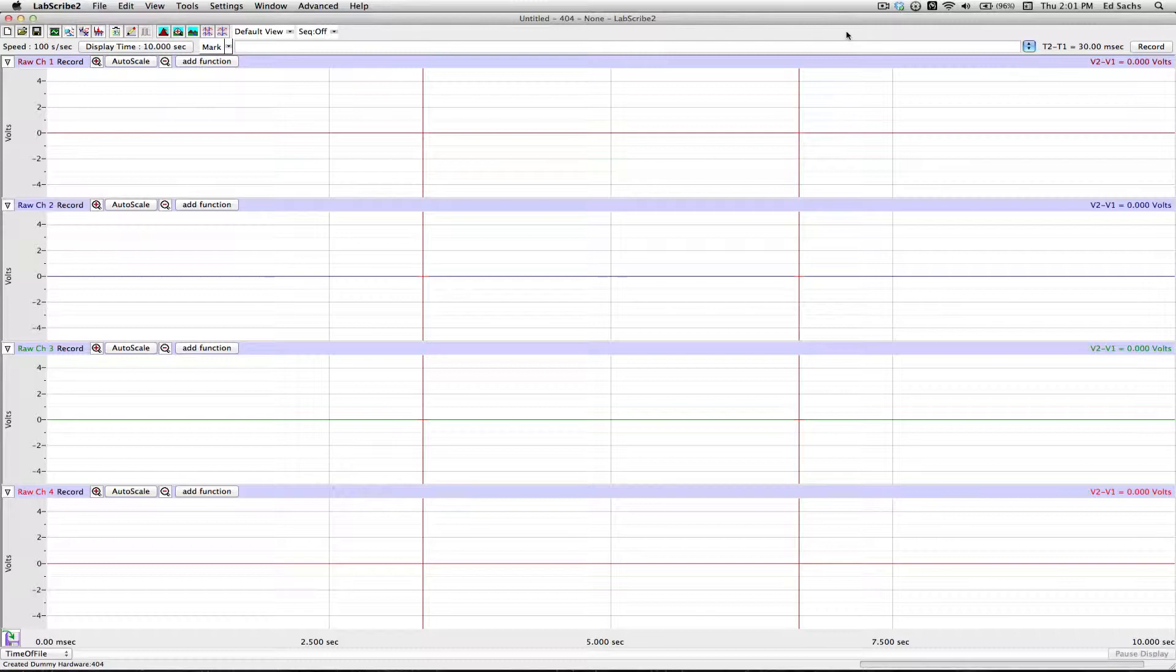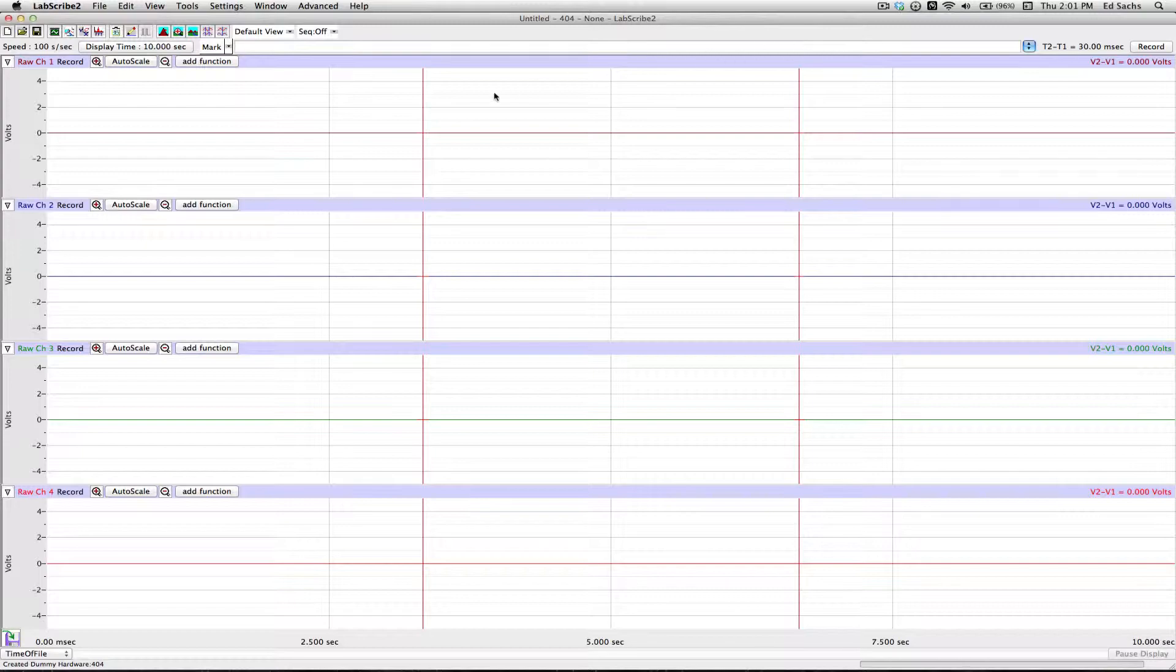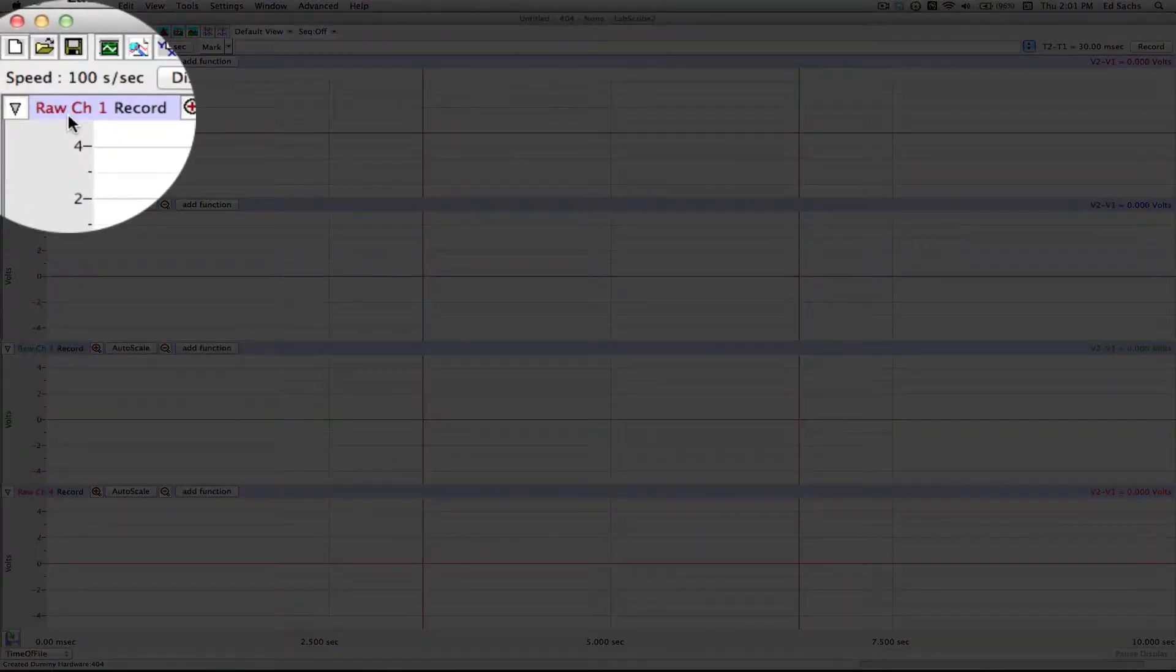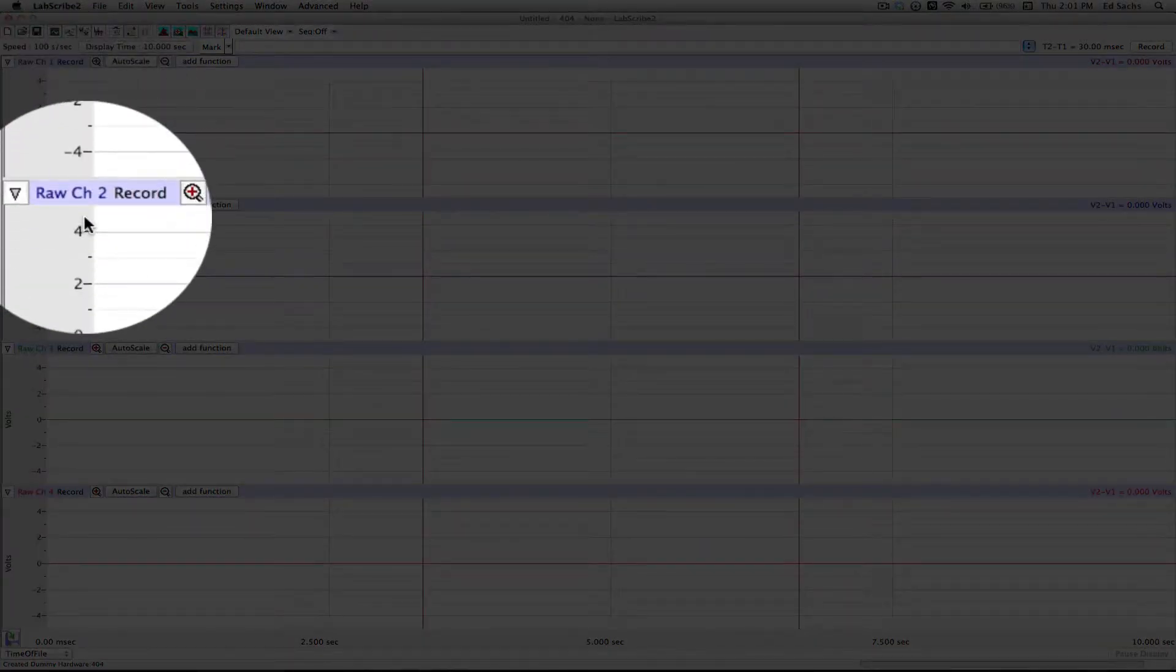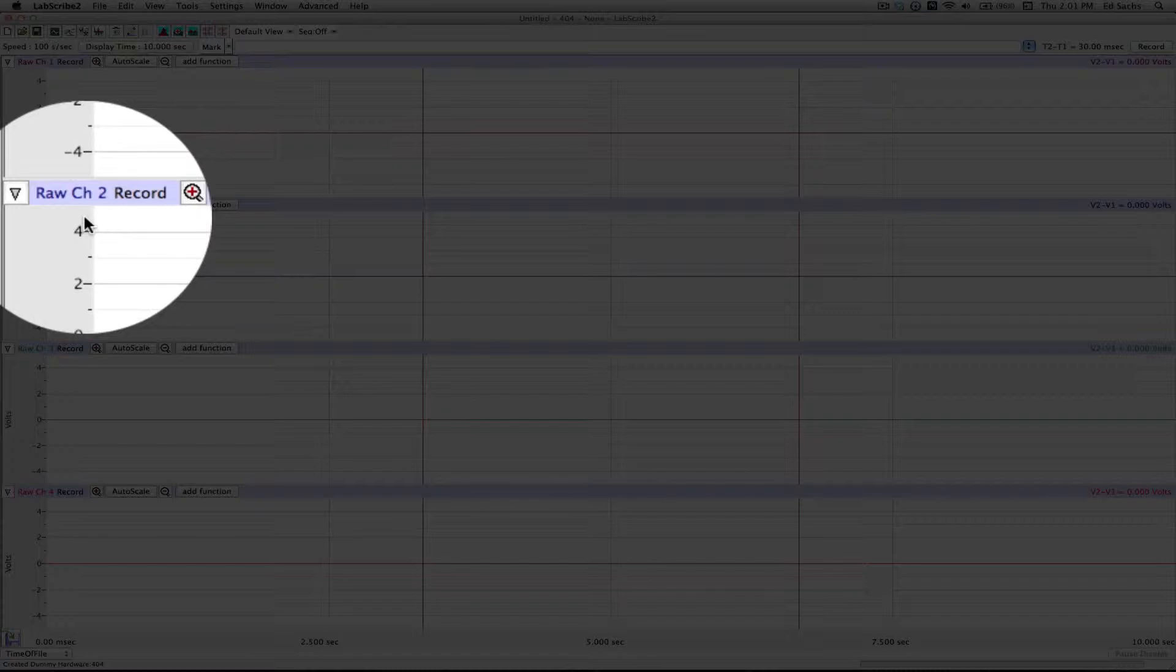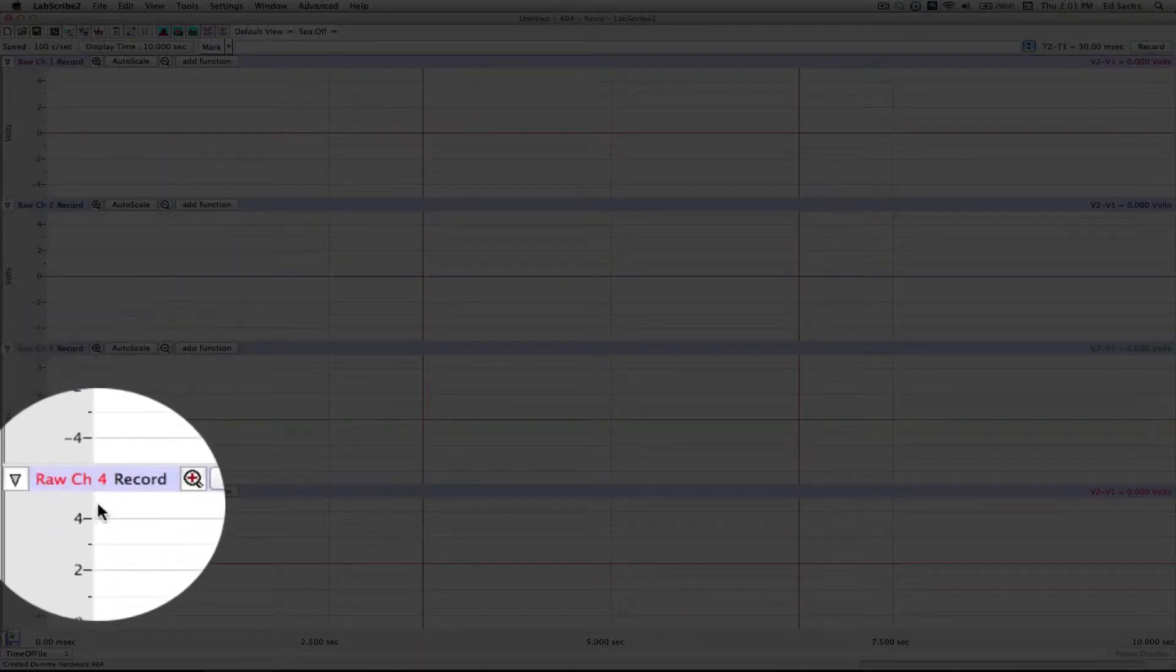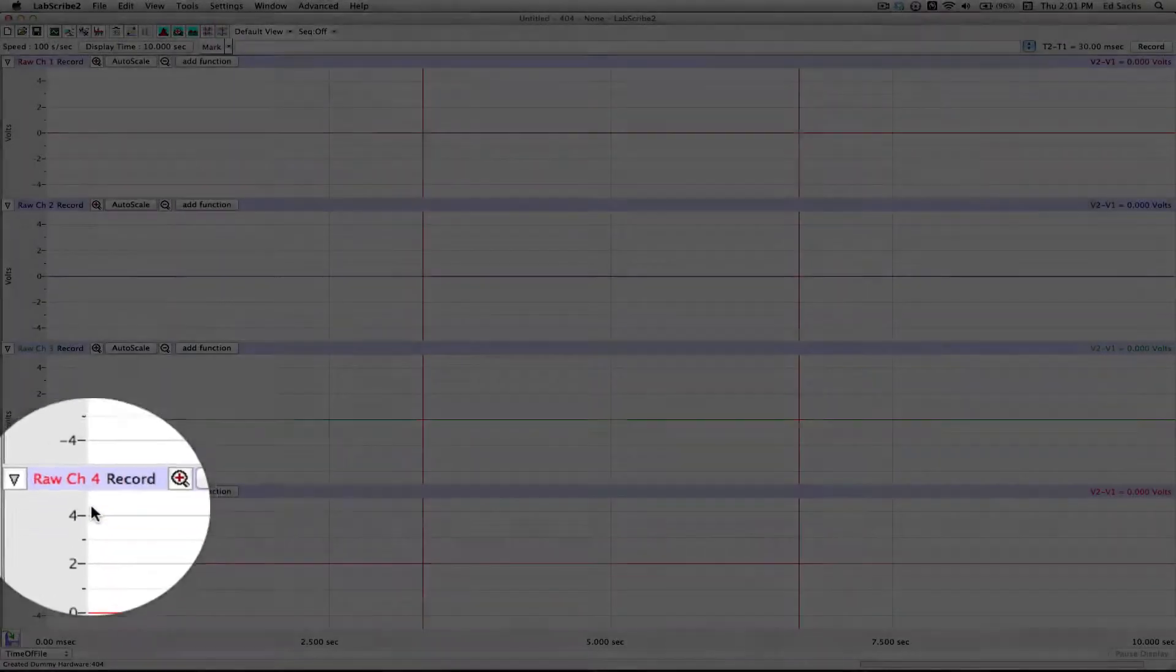To set that up ahead of time in LabScribe, we can set up a protocol. LabScribe, by default, comes up with four generic channels named RAW Channel 1, RAW Channel 2, RAW Channel 3, and RAW Channel 4.